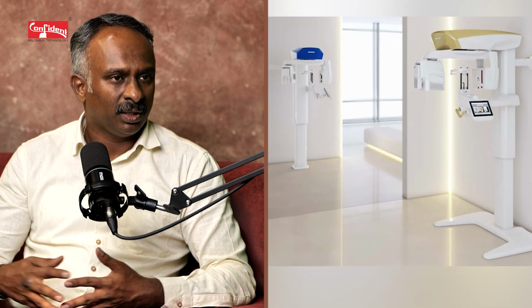But if you want a CEF, I think the component would be slightly bigger, so the size of the room would be slightly different. But for a CBCT, 6 by 6 feet with a regular wall with barium paint, or you can use lead glass. And it is preferable to have the machine at an end where not many people are moving around. So this would be the basic requirements which are essential.